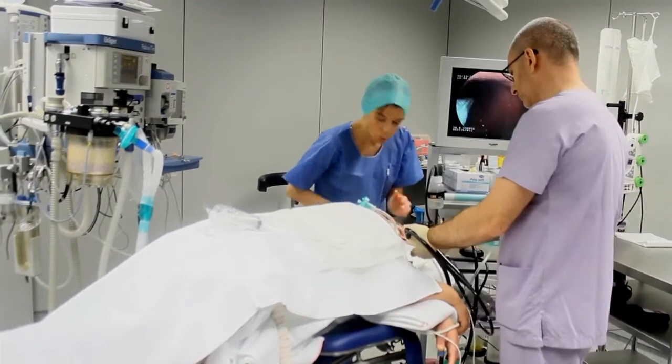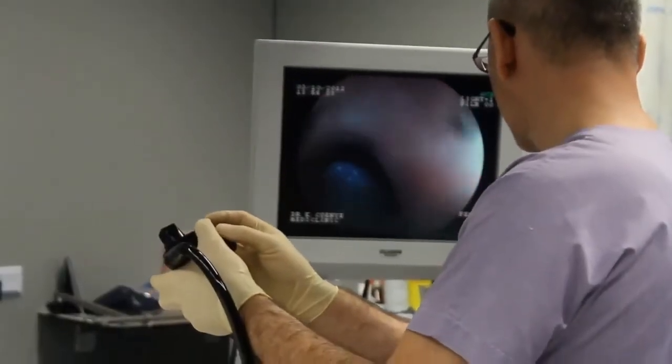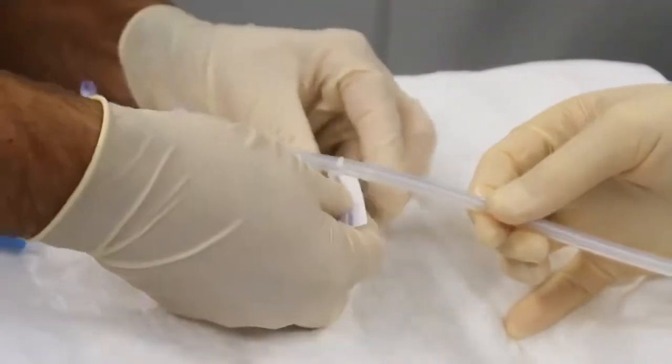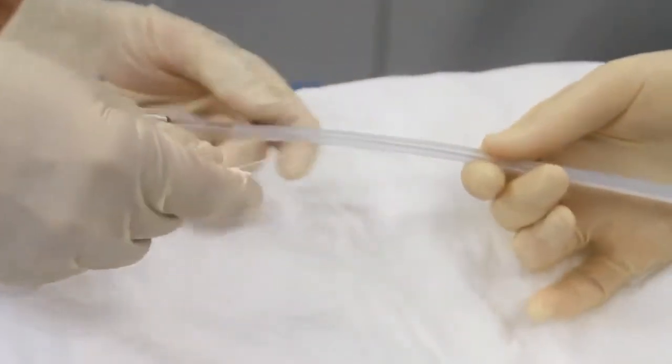Therefore, use an endoscope to help move the balloon correctly into the stomach and to help control the good positioning of the balloon. The blue valve must be located 2 centimeters below the cardia level. Remove the blue-colored safety tape by opening the flaps and then unrolling the thread from around the introduction kit. This will allow you then to pull on the thread.